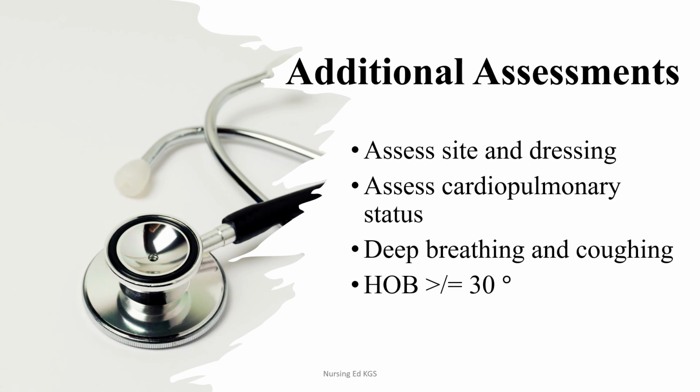chest tube was inserted, the location, and the insertion date. By knowing all of this, this will inform you as to the type of drainage to expect and the type of care that the patient may need to receive. You'll also continue to do your site and your dressing assessments, and you'll also continue to do your cardiopulmonary assessment.